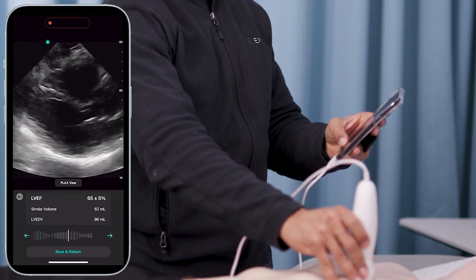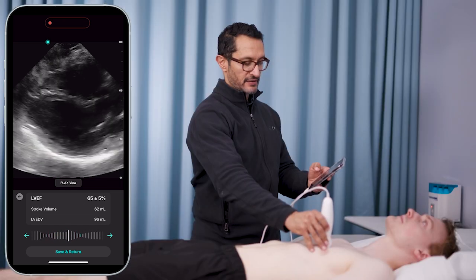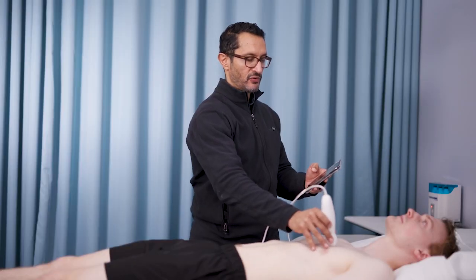It also allows me to scroll back and forth to review my imaging. The next view I'm going to go to is the apical 4.